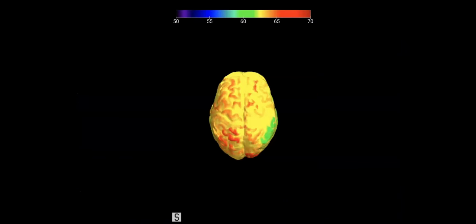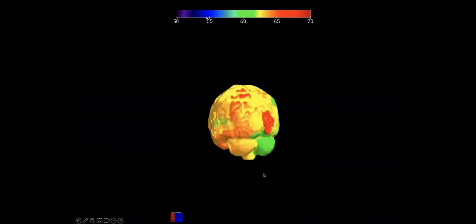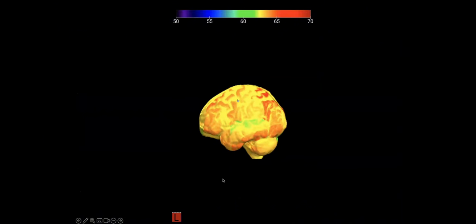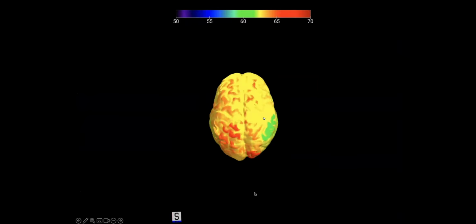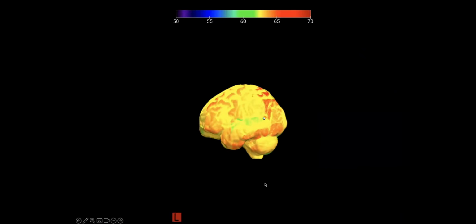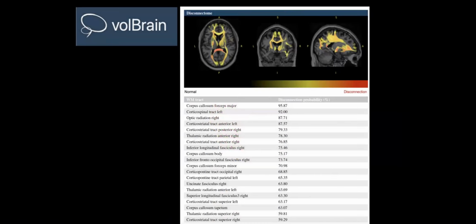And so again, this is an example of the brain aging in this individual. Again, if it was a regular brain age of 54, it should be all blue. It's all yellow and red in many areas because again, we see this asymmetry in particular related to the kind of counter-coup injury. And again, this accelerated brain aging overall into the 60s is far too abnormal for an individual of 54.